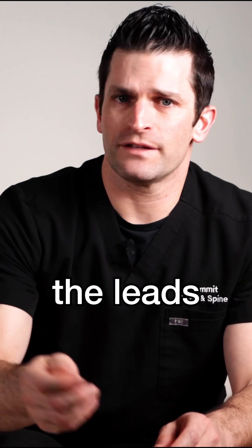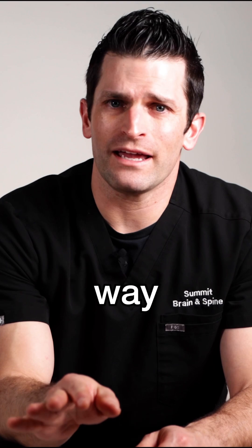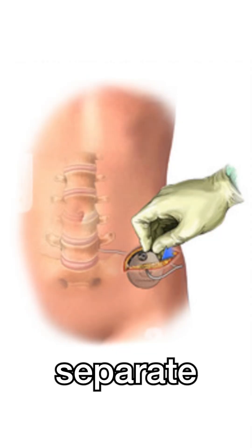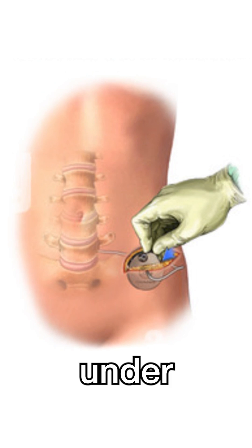Once the trial is over, the leads are removed. The difference between the trial and the permanent is the battery. The leads are placed the same way and then they're tunneled to a separate incision and a pocket where a battery is placed and connected under the skin.